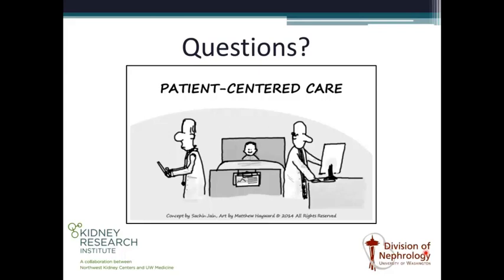There were some falls in people who have been treated and had low blood pressures at night. And you've not presented any data at all on chronic kidney disease, and including diabetes medications. I wondered if you could say a few words about that. Yeah, I think that is hopefully one of the reasons to do ambulatory blood pressure monitoring, to prevent overtreatment of a patient who has an intense white coat effect. So hopefully we'd be preventing some of those adverse outcomes, but I'm not sure I'm getting at your exact question.